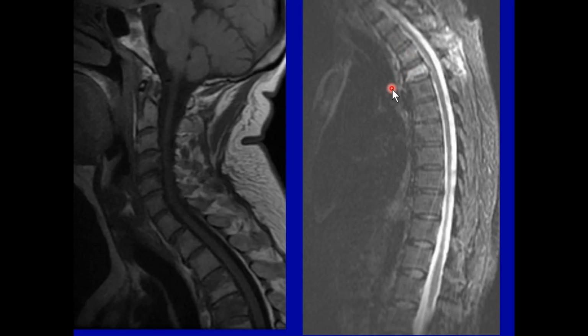So that's on the RadTech, whether it's positioning, but not every X-ray will turn out. They're more likely to turn out when the positioning is done well. Now, whether it's a 5-degree or 10-degree tube tilt, in other words, I'm hoping that RadTech would take a look at what the positioning should be for the swim lateral view so that that isn't repeated.